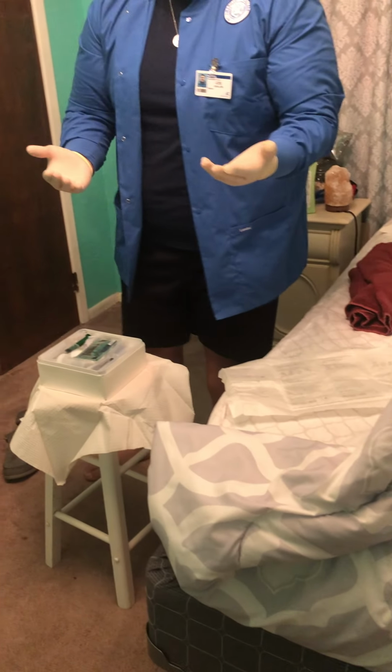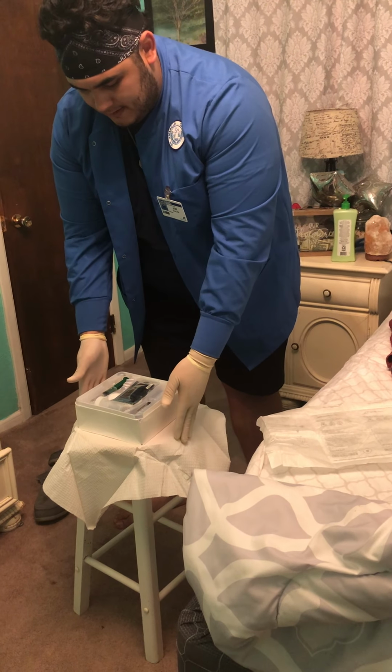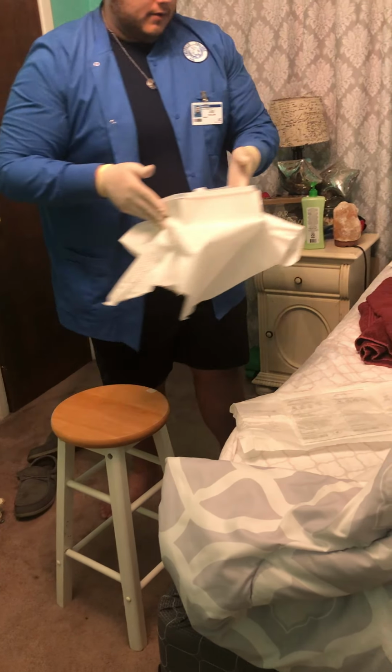Alright, so since we do have sterile gloves on, we can touch the inside of this pack. So we're going to go ahead and come over here.